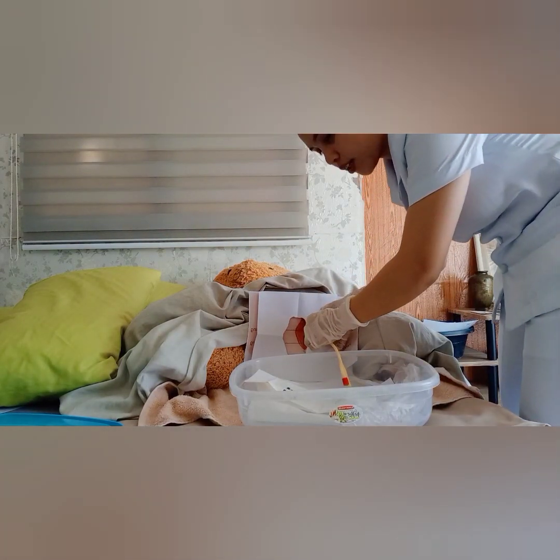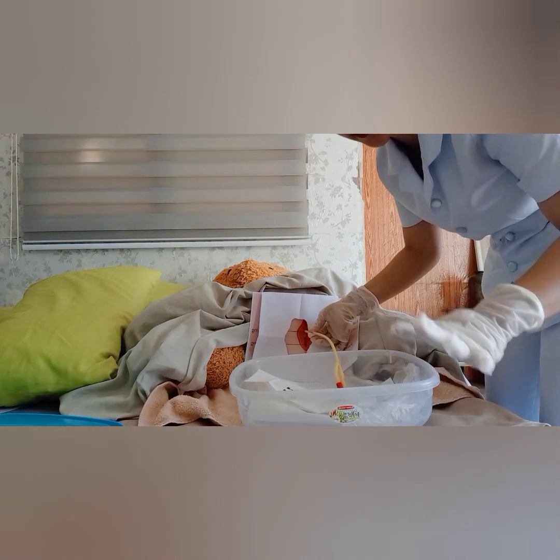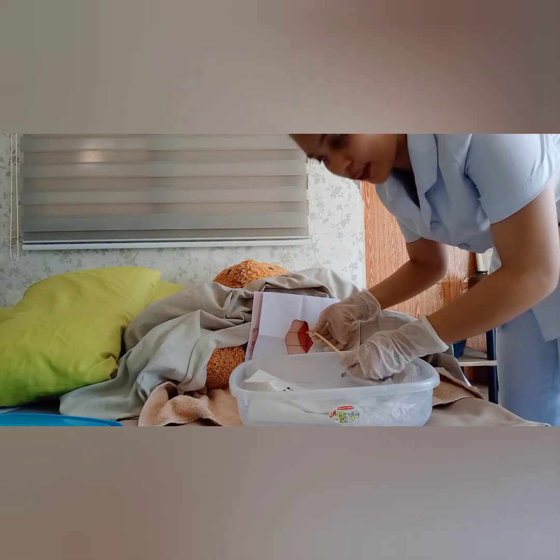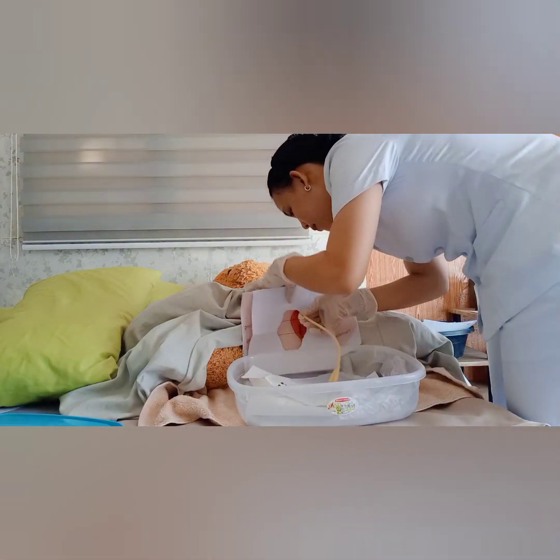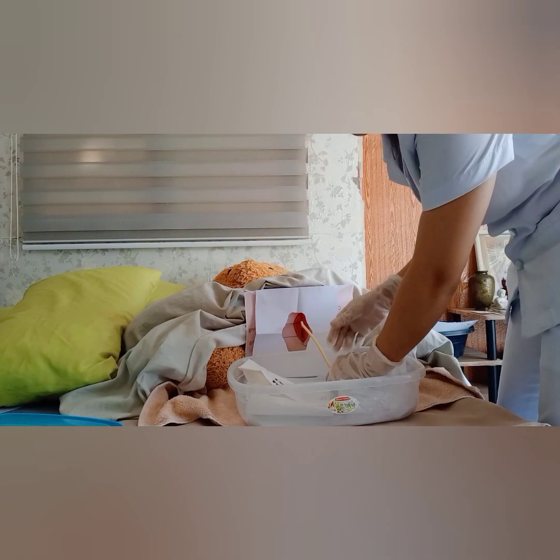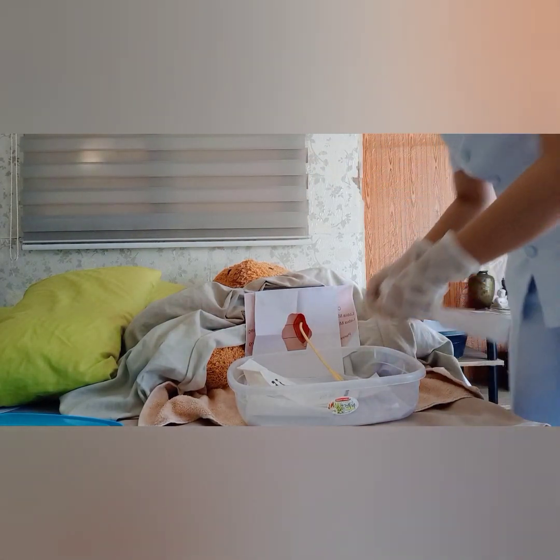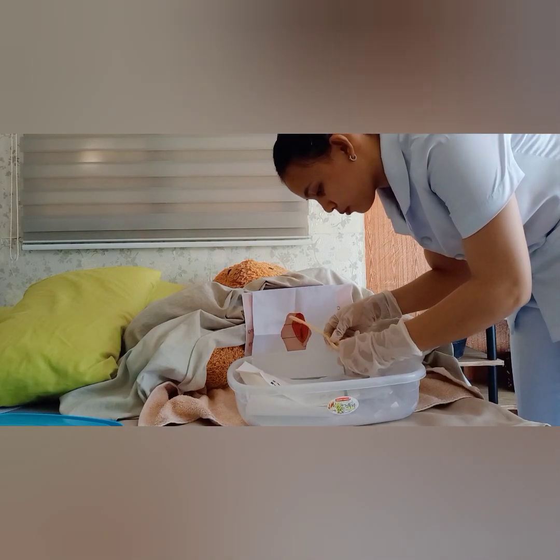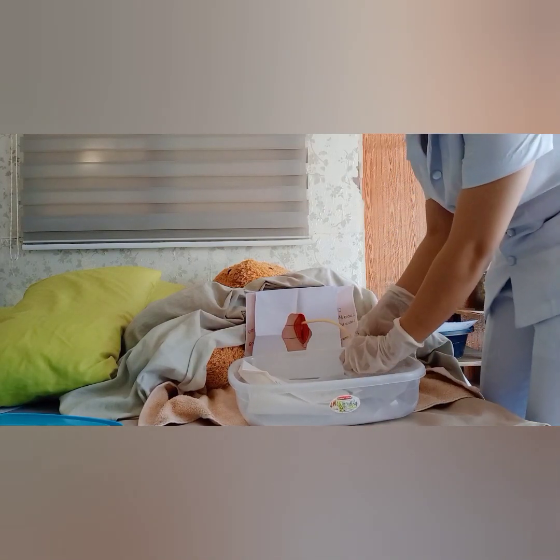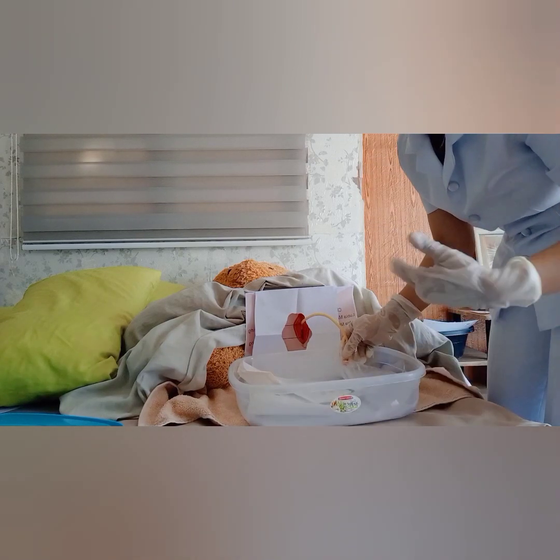Okay, so the next thing that we are gonna do is press the hand on the pubic area while holding the catheter in place, to prevent pulling and pushing of the catheter. Okay. So connect the catheter to the urine bag. So I will now get my urine bag. Okay. So the rationale for this is to allow the bladder to drain freely by gravity.